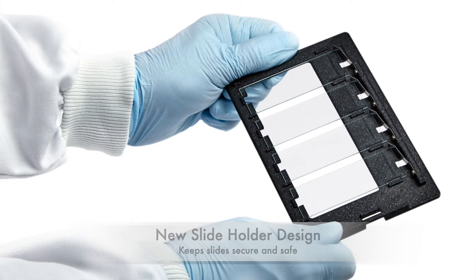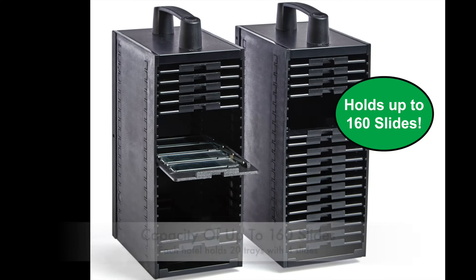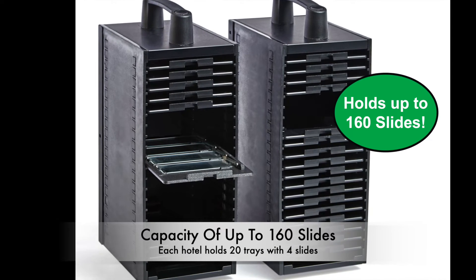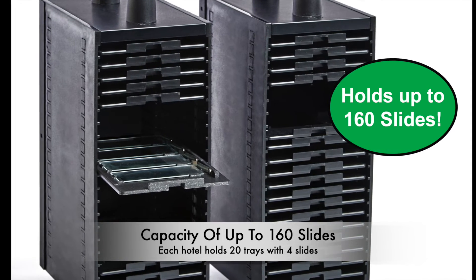The system comes with an optional slide assistance platform that provides effortless loading and unloading of slides. The SL160 has a capacity of 160 slides, which are housed in easy-to-access hotels.